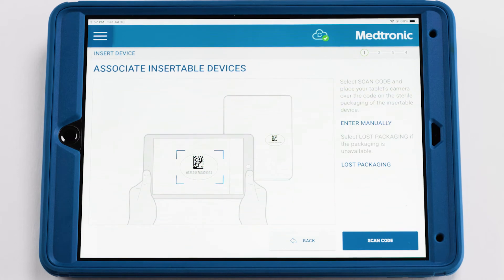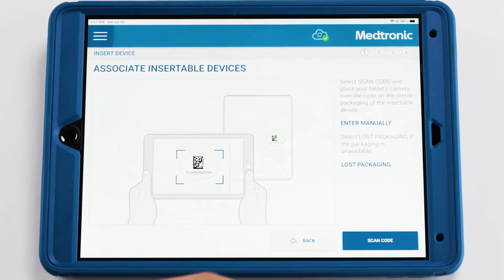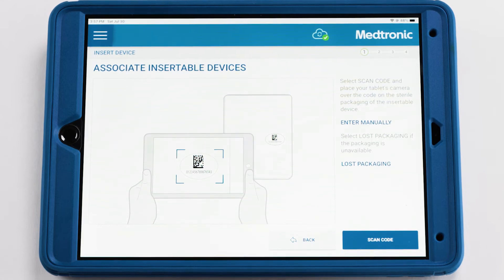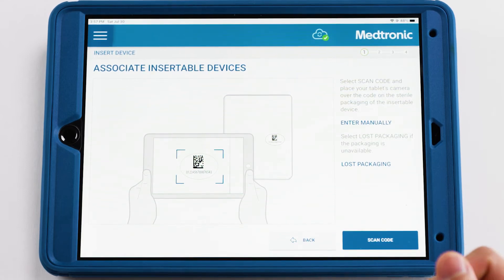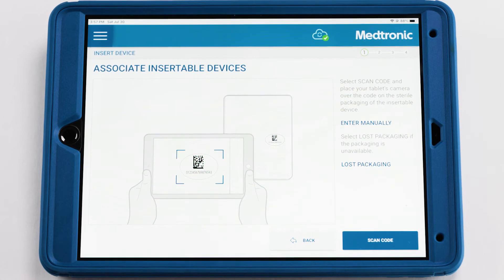After connecting the device, the next step will be to associate the MyCareLink Home Monitor with the patient. This can be done by using the tablet camera and scanning the monitoring packaging. Doing this will allow the home monitor to send data from the RevealLink to the CareLink network from the comfort of the patient's home.